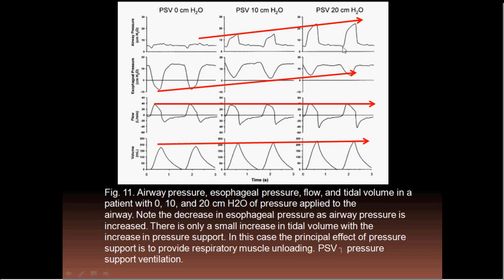This is the driving pressure, which is the difference between the PEEP and the set pressure. So this is the driving pressure of the machine, and the patient takes some sort of inspiration. He's making another driving pressure. So this is the inflating pressure of the machine, plus the driving pressure of the patient. The two together give us this tidal volume.